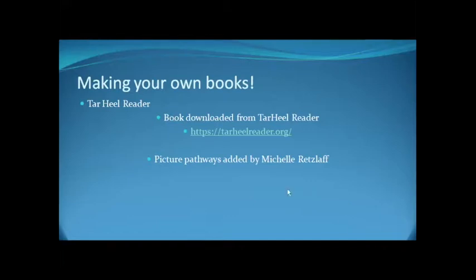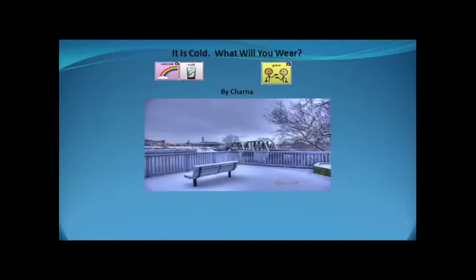So this is a book that somebody I work with, Michelle, found, and then by using the Chat Editor, she was able to put the templates on as to how to say some of these words. And I really like how she did this, because she didn't try to have the kids read every single word. You're not going to do that when they're first using their device. You're going to be teaching them a few words that they're going to be saying as you're reading it. It is cold, and then you're going to show them where to find cold on their device.